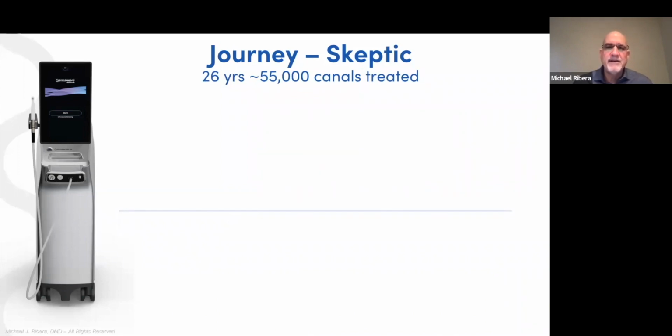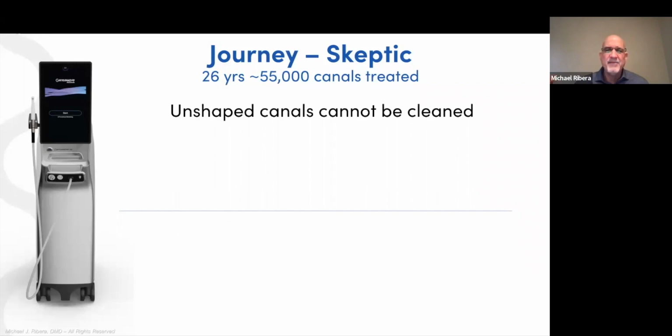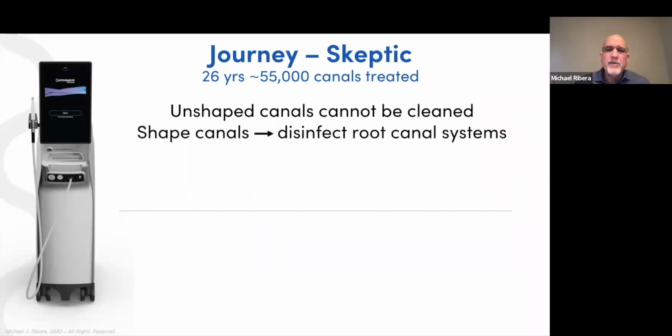And Brian absolutely is clueless as to what I've done for the last 26 years. He has no idea that that's how long I've been practicing, and that I've treated successfully, I would say, about 55,000 root canals, following these sacrosanct concepts that I'll show coming up soon, which was at the time and still is for most a universal mindset. Concepts such as that a canal that has not been shaped cannot be cleaned. That the only reason why we would shape canals was so that we may then disinfect root canal systems, because files shape, but it is irrigants that clean. So we had to shape them a bit wider so we could clean them.